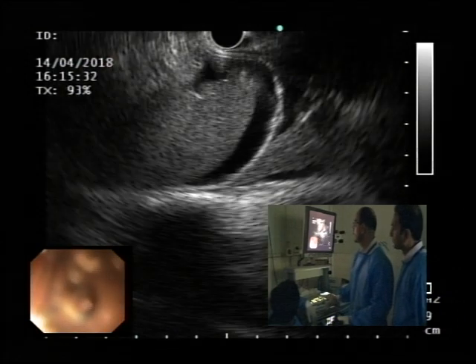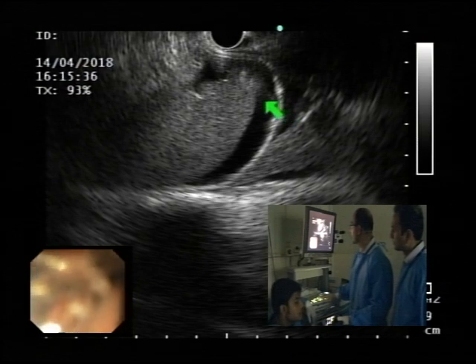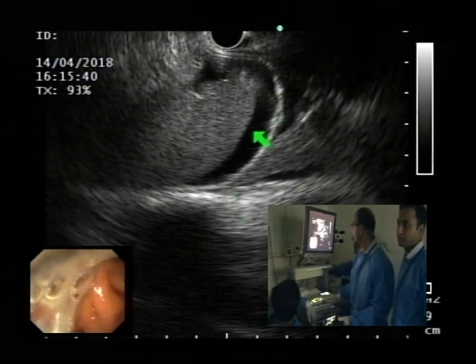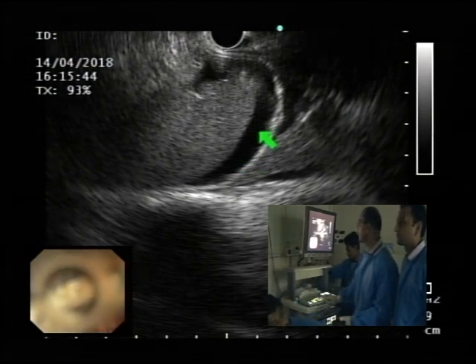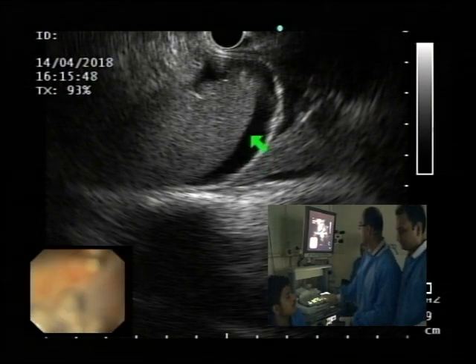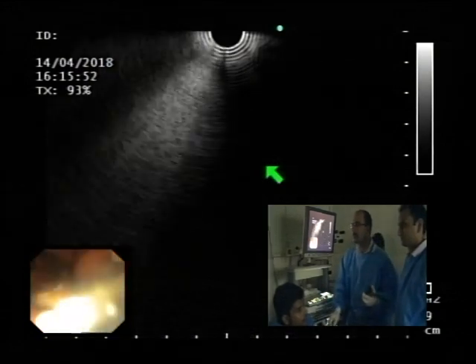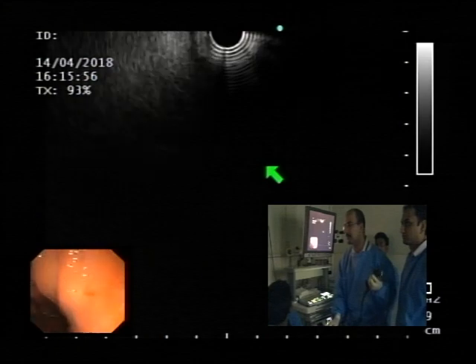Right. So did you hear that? Can you hear us? Yes, we can hear you. Okay, so any of our candidates want to hazard a guess what this is? They say it's ascites. Good. So ascites, and also I forgot to mention she does have a history of hepatitis C as well.